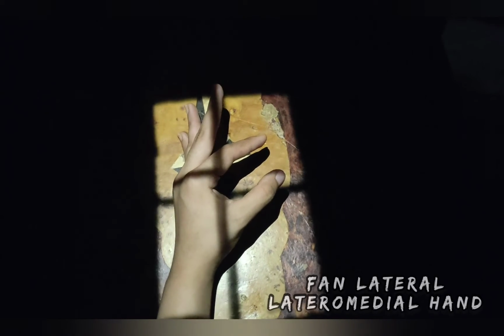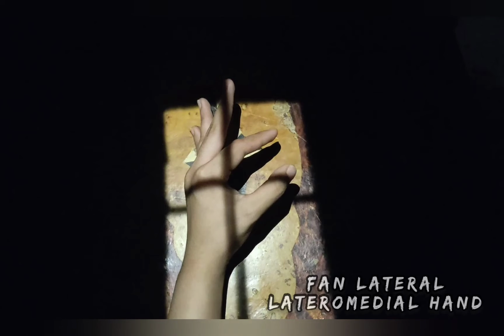Fan lateral or lateromedial projection, hand. Patient position: sit the patient at the end of the table with the elbow flexed about 90 degrees and the hand and forearm resting on the table. Part position: rotate the hand and wrist into lateral position with the thumb side up. Spread the fingers and thumb into a fan position. Then the CR is perpendicular to the IR, directed to the second MCP joint.